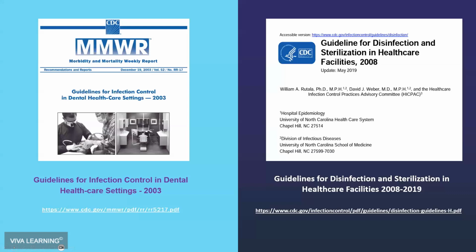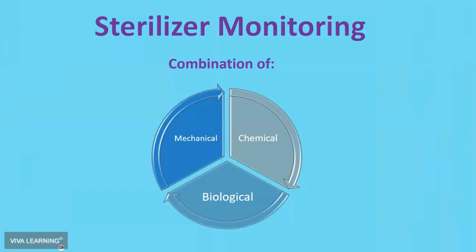The guidelines from 2003 from the CDC are in the process of being updated right now. Not that a lot of the information has changed, but we're looking now at a 20-year-old document. So the CDC wants to make sure that it appears to be more current than 20 years old. So in the CDC guidelines, either the sterilization guidelines that I didn't really talk too much about, but the guidelines for infection prevention and control in dentistry, sterilization monitoring is not just a periodic spore test.